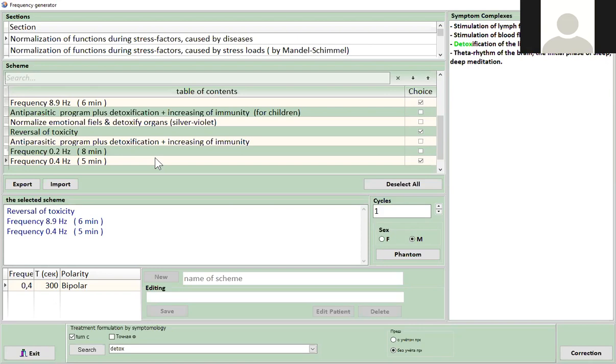But if someone was using it at home and it fell on the floor, it probably would not be active anymore. No, it doesn't matter. So it's better not to touch them and not to rub them. If it falls down on the floor, it doesn't matter. So nothing will happen with it. Okay, so just not to touch it too much.